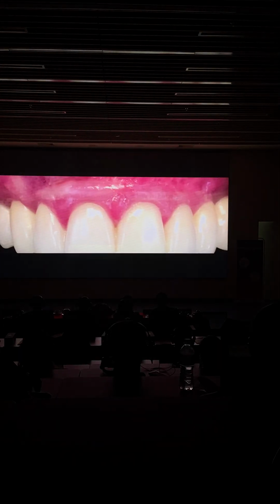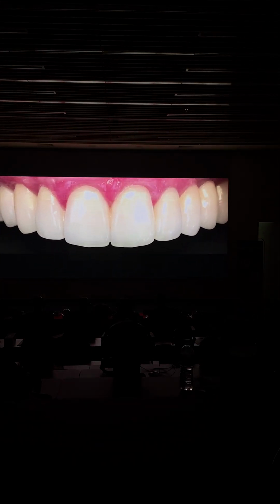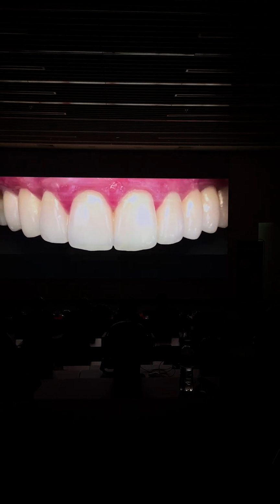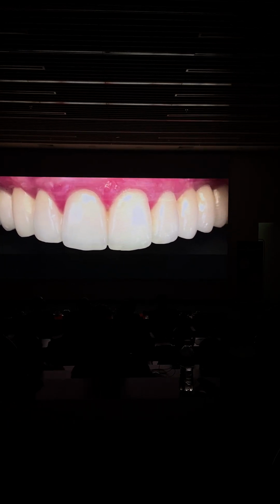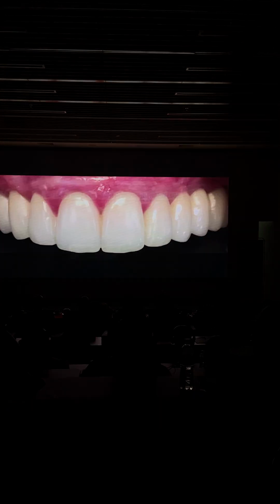So you don't need to, this is from Smileline, they came up with another prototype. You don't need to calibrate your camera. It's true that sometimes the colors are not as nice, but you can see here the canine area where we didn't have any horizontal.